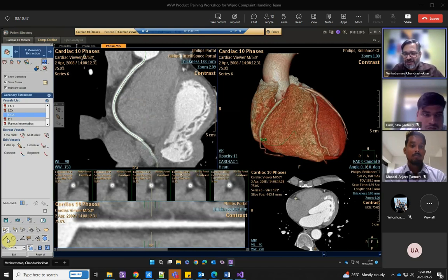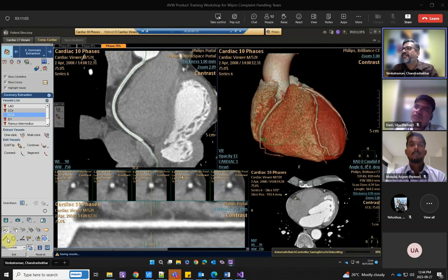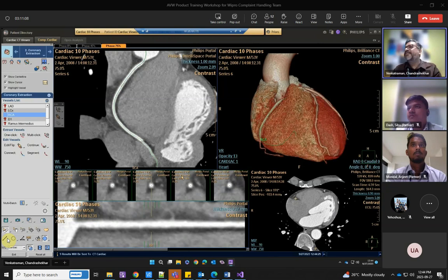Even in the regular batch, when a batch is being saved, it takes more time to process, then the save dialog comes, and then again it saves. Imagine how much time is wasted, almost 6 to 7 minutes per phase, if I have to say. Just imagine how long doctors have to spend, days together with so many patient studies. If they have to spend so much time on one study itself, that will be really exhausting.